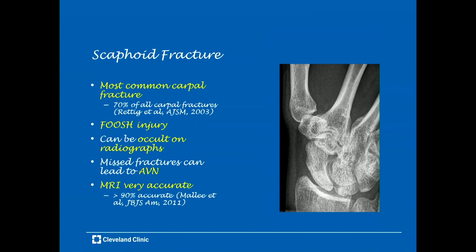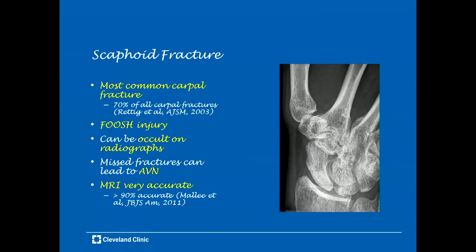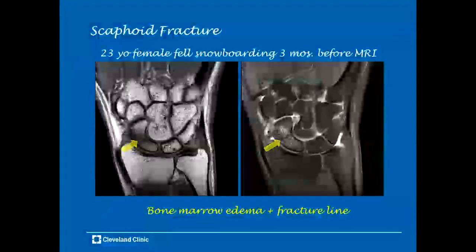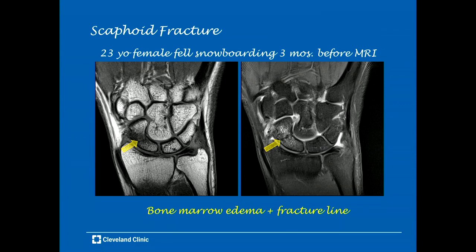One of the most common fractures that MRI is used for is the scaphoid fracture — the most common carpal fracture, accounting for 70% of all carpal fractures. It's usually a result of a fall on an outstretched hand, can be occult on radiographs, and missed fractures can lead to avascular necrosis. MRI is very accurate for identifying scaphoid fractures with greater than 90% accuracy reported. Here's a case in a 23-year-old female who fell snowboarding three months before the MRI. There's bone marrow edema on the T1-weighted image and the T2-weighted image, and a low linear T1 and T2 signal line through the waist of the scaphoid consistent with the fracture line — the key way to differentiate a bone contusion from a fracture.